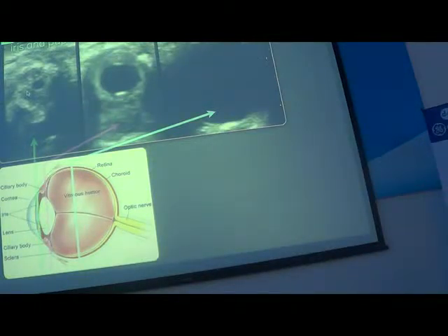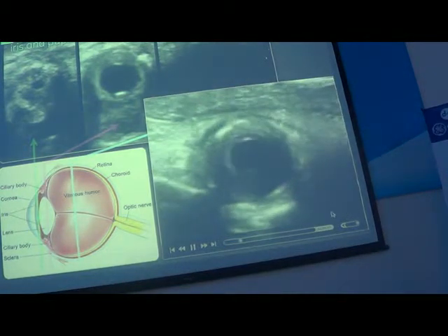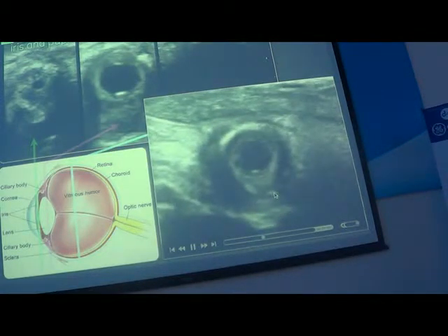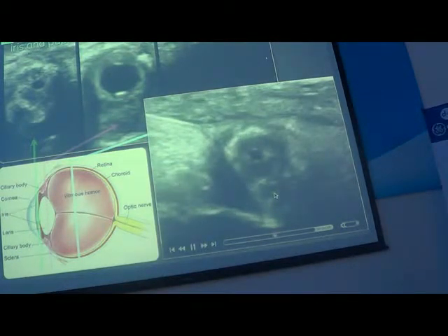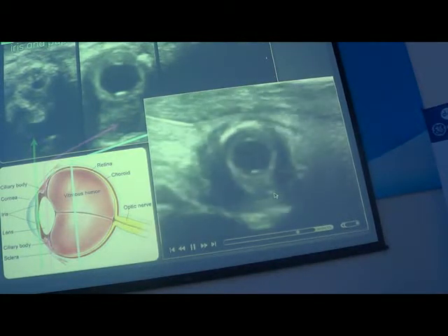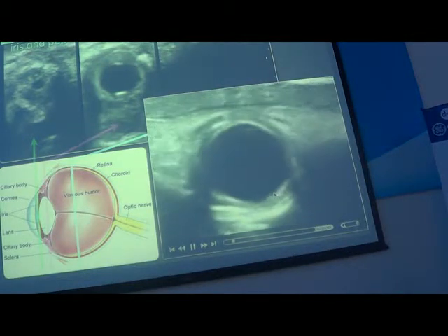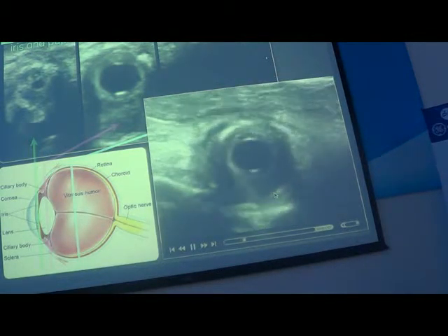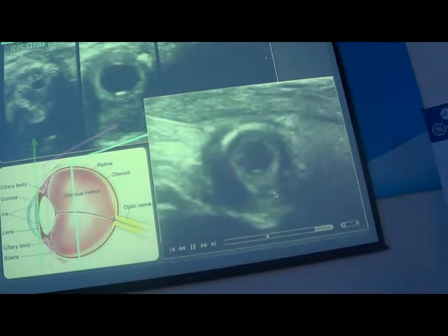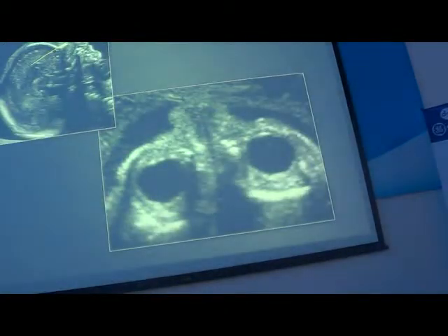Đây là đồng tử. And you can see here with the video, we move from the deep to the superficial part. Đây hình ảnh 3D, hình ảnh 2D chúng ta đưa lát cắt từ sâu cho đến nông. But you can obtain this only by using a high frequency probe, a linear probe. Tuy nhiên lát cắt này chỉ đạt được khi ta sử dụng cái đầu dò linear, cái đầu dò dẹt.